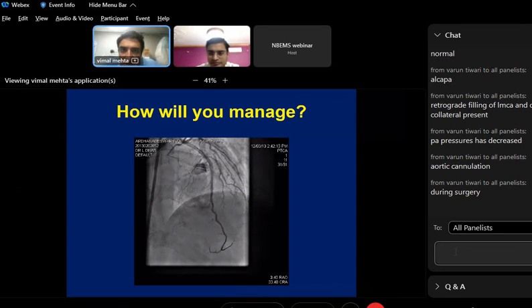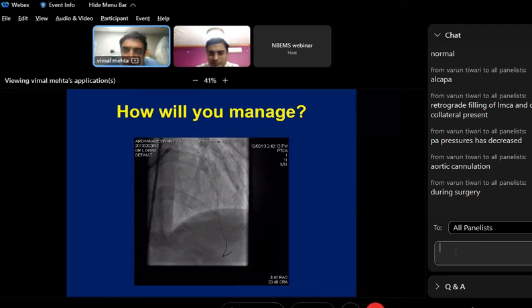So you have to mention everything. You don't have to take 1,000 years to answer it. Covered stent, maybe? What will be the first step you will go for? Managed by a covered stent. Okay, covered stent. Of course, you can put it anywhere in the artery. But I'm not going to, because covered stents have a very, very high restenosis rate. So it is best to avoid them.